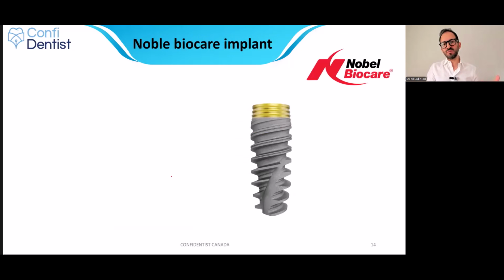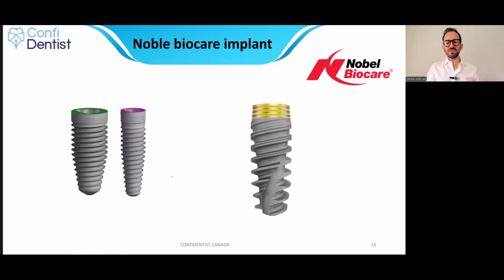Then we have the Nobel Biocare. They have a different design. Nobel Biocare has tissue level, has bone level, but the bone levels are much more popular. And when you pay attention to the Nobel Biocare, you can actually appreciate the micro threads in all different lines, more obviously.